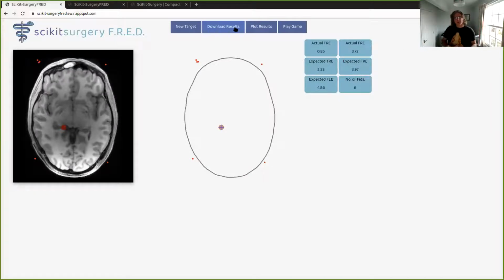If you want to do tests of significance, there's a download button. You can download a CSV file and stick it in whatever your statistical analysis program of choice. So that works well. We've deployed this. It's a good teaching tool. It's flexible, enables you to cover a range of concepts very quickly, much more quickly than if you were doing pointers and stuff in the lab. You can realistically do hundreds of registrations.